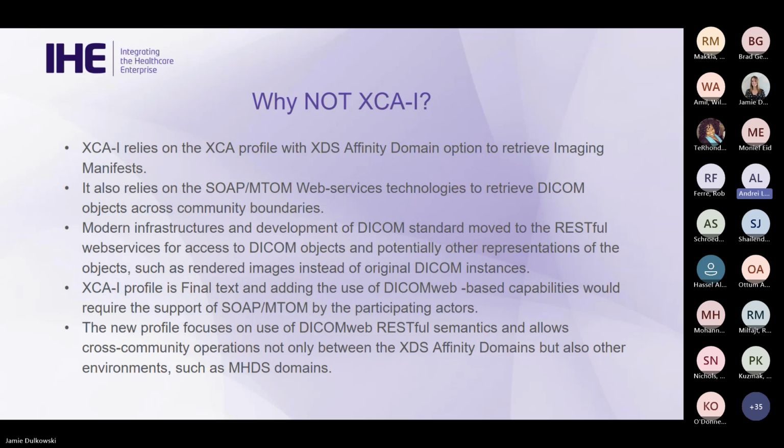One is the XCAI relies on the XCA profile that also explicitly implement the actors of which explicitly implement the XDS affinity domain option to retrieve imaging manifests. The imaging manifests are being the documents typically encoded as DICOM KOS objects that contain the list of images or instances, DICOM instances, which have been published by the source to be shared.